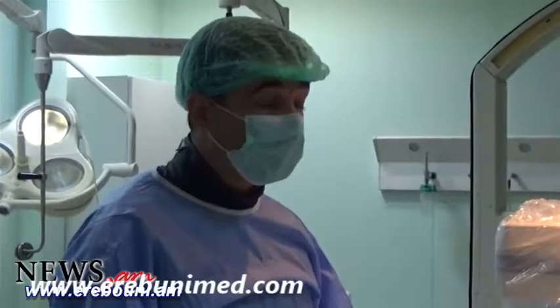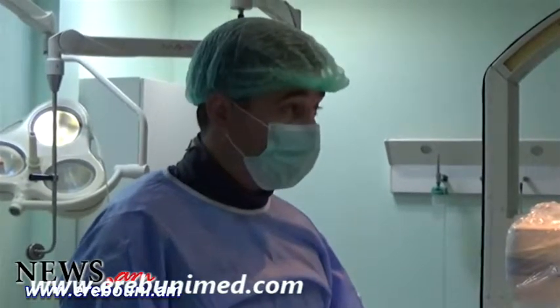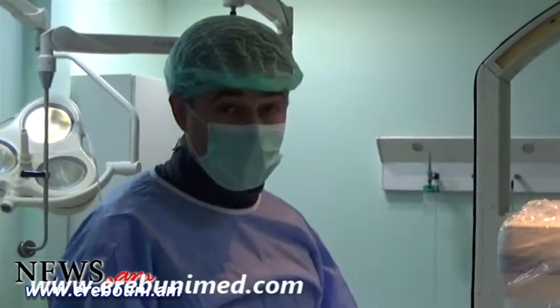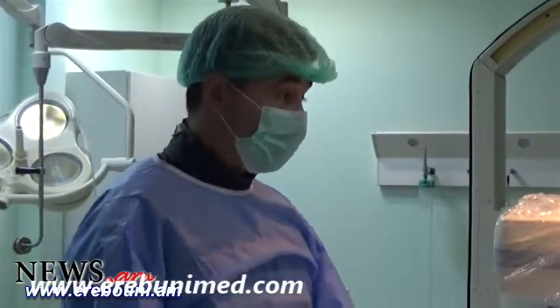As the patient has no children yet, she preferred this intervention, which is not inferior to the first two in terms of effectiveness. The surgery is carried out under local anesthesia, and now we must anesthetize the inguinal area for catheterization of the femoral arteries.